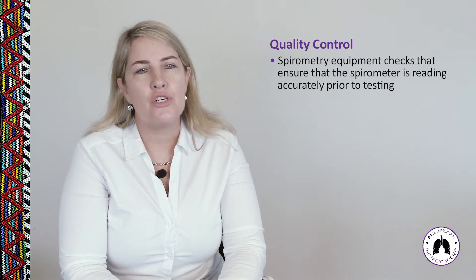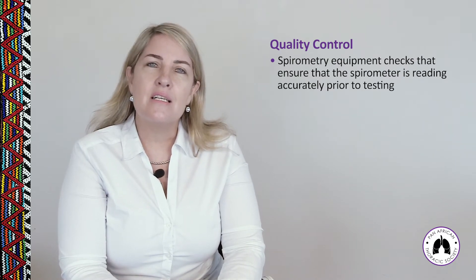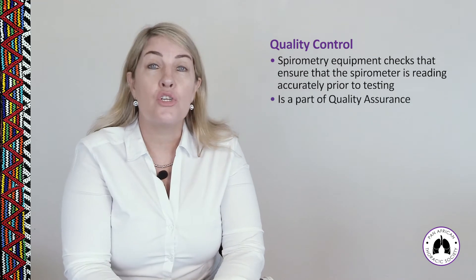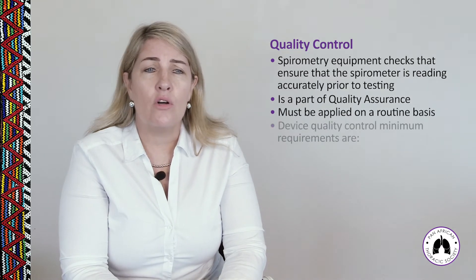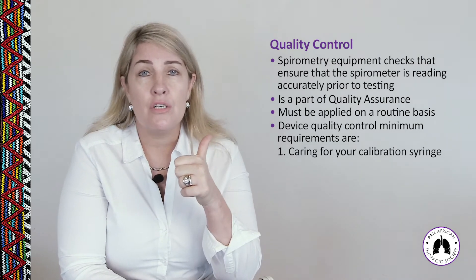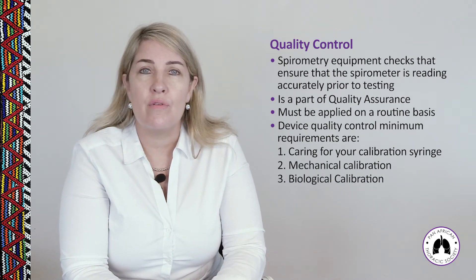Quality control refers specifically to spirometry equipment checks that ensure the spirometer is reading accurately prior to testing, and it is part of quality assurance. Quality control procedures must be applied on a routine basis. The device quality control minimum requirements are: care of the calibration syringe, mechanical calibration, and biological calibration.